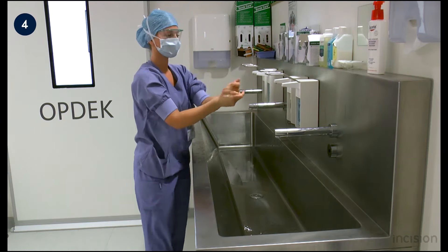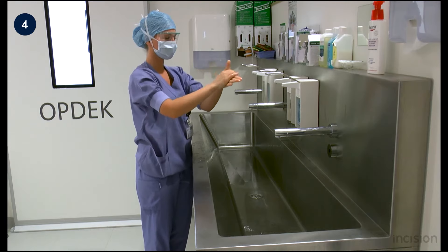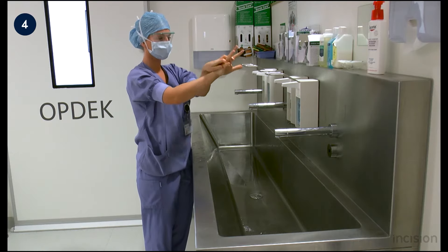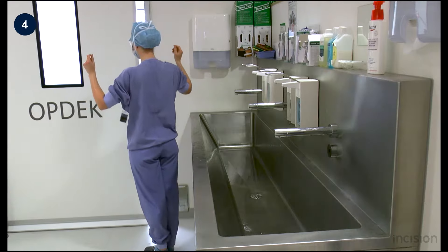The second time the alcohol is only applied to the hands and is also rubbed until it is dry. Keep the hands high to maintain sterility.